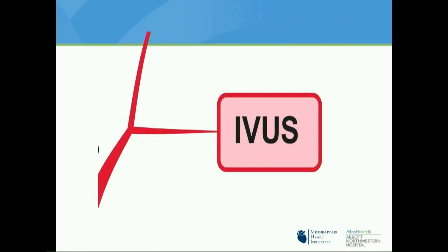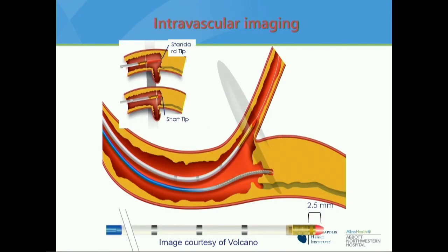IVUS use is of a great deal of importance, and I've resisted over the years using IVUS and found that was hampering my practice and my patients, and now I use it quite a great deal. The idea in these cases is that when you've got a chronic total occlusion, as everybody knows, it generally closes off to the point of a major branch, and that's where the ambiguous cap generally is.